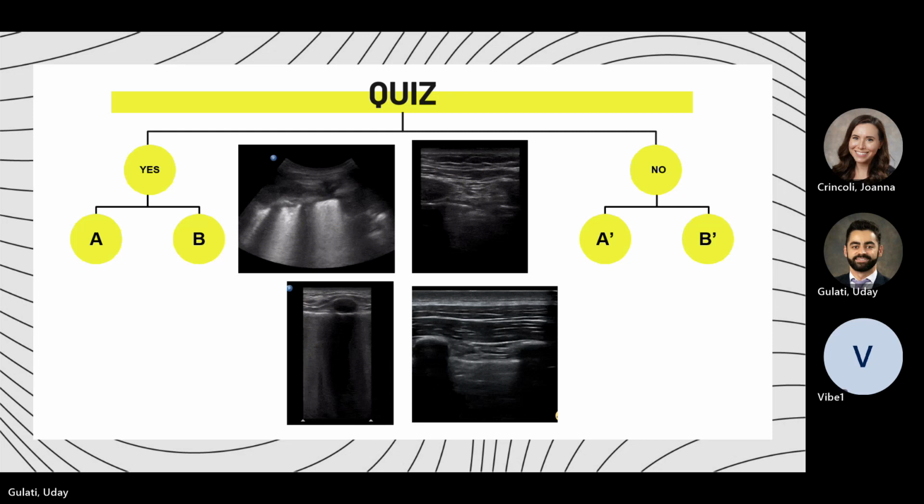Right? If I just see that when I'm doing the M mode, that's going to be concerning for a pneumothorax. Highly suspicious for a pneumothorax in that region. But if I'm going around that region and I get to this point, what I'm going to see here is this barcode, but then down here, I'm going to see stuff.